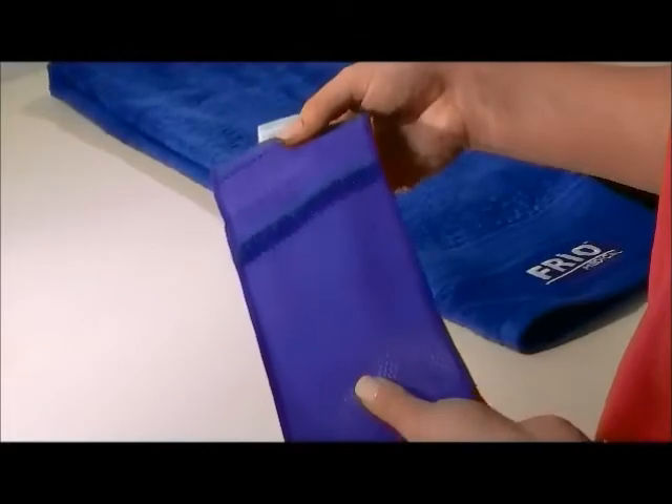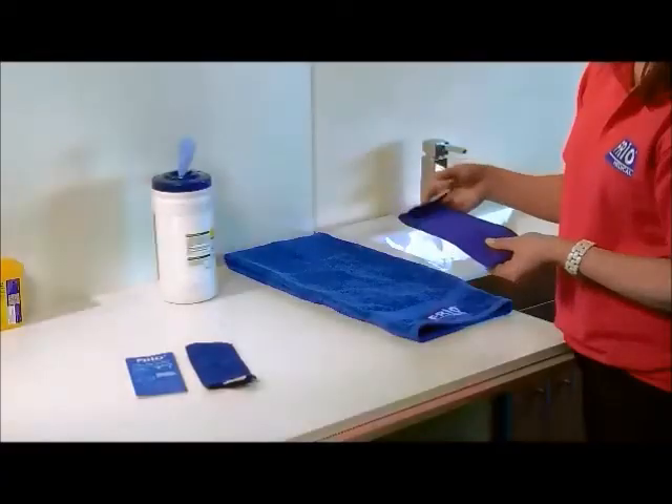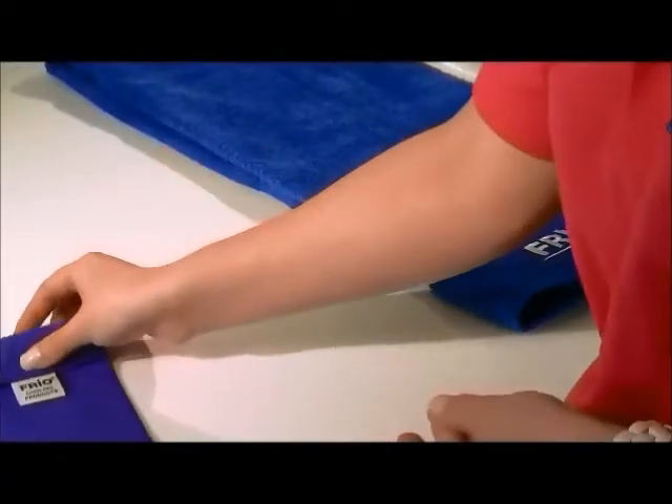The Frio Cooling Wallet works through evaporation, so it will need to breathe at all times to work effectively.